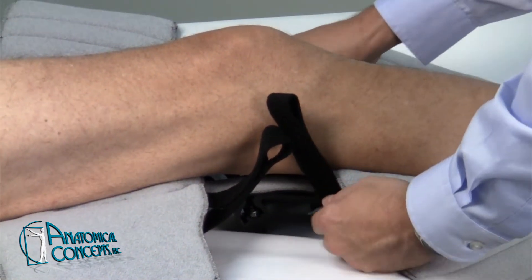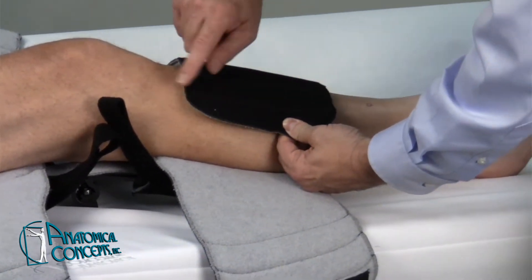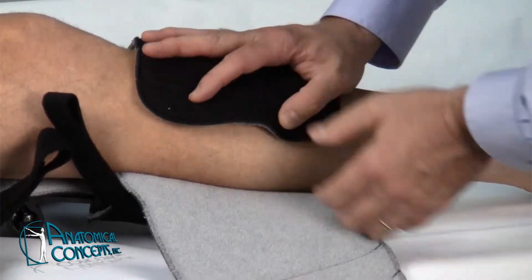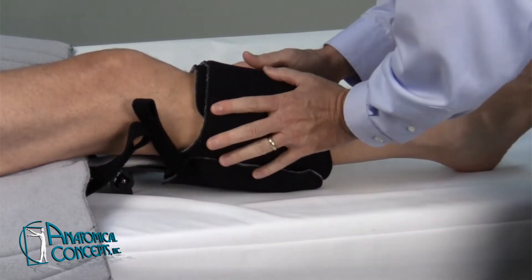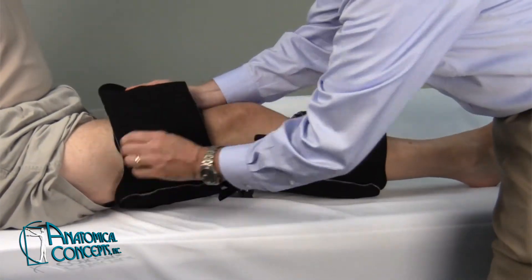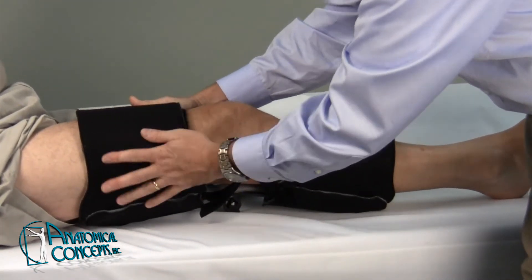Once you get that positioned, go ahead and fasten up the calf section first. You can see where we have areas of stitching, so you can trim this off as necessary for the patient's varying calf size if appropriate. Go ahead and wrap that around and stick it down with the Velcro closure. Proceed up to the thigh and fasten that, making sure the lining is smooth underneath with no wrinkles.